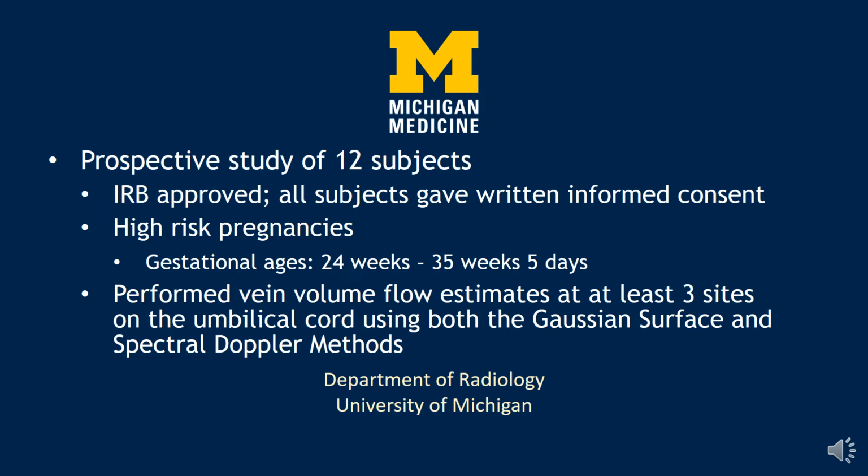Also, it didn't matter that they were high-risk pregnancies because we were not interested specifically in the flow rates that we were measuring. We were interested in the variations in the measurements. So if their measurements were high or low relative to normal values, it didn't really matter as part of this study.